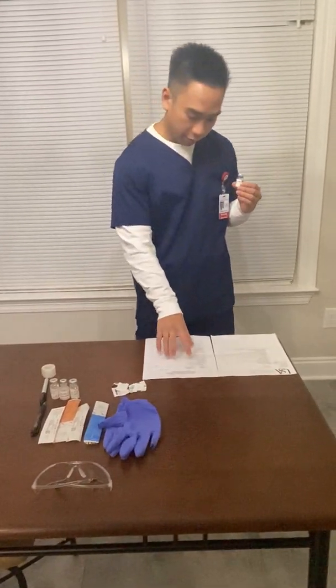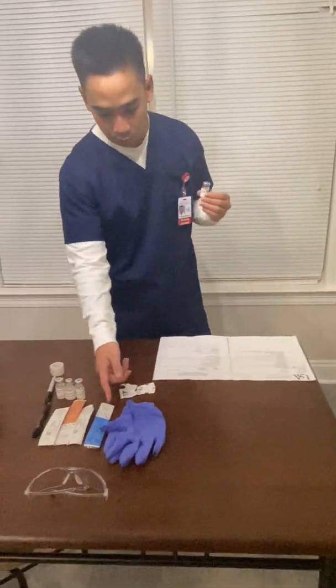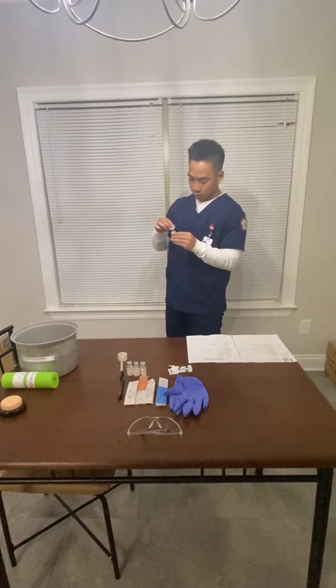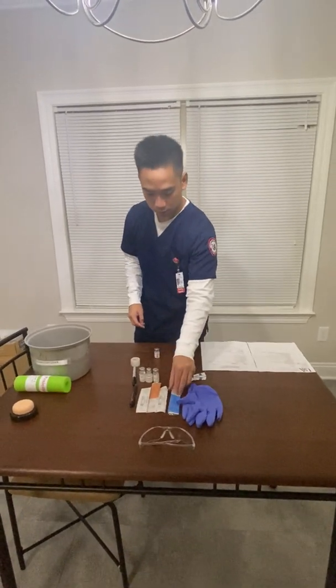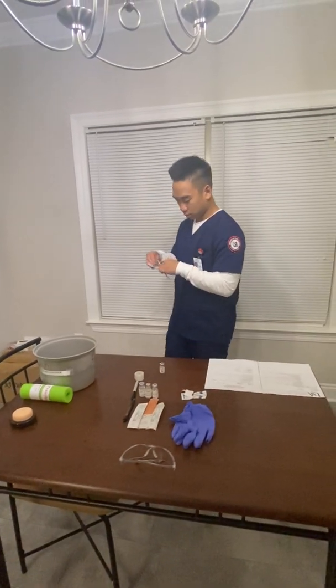Then I'm going to re-verify the time. So it's been 12 hours since the last injection. Today I'm going to be using my 1 milliliter TB syringe. So after that, I'm going to clean the top of my vial. I'm going to grab my syringe.